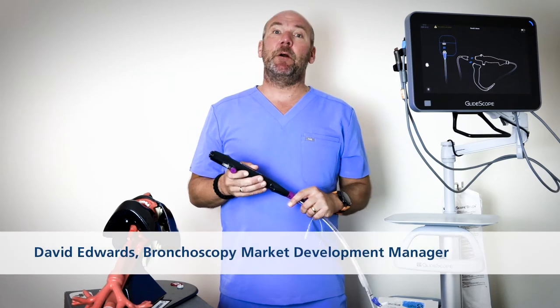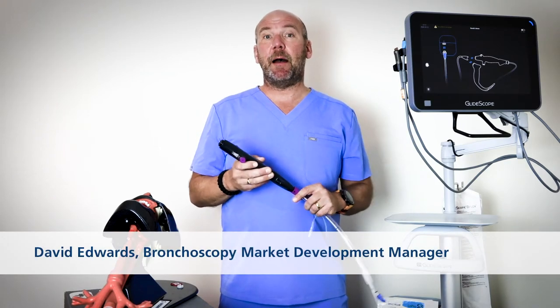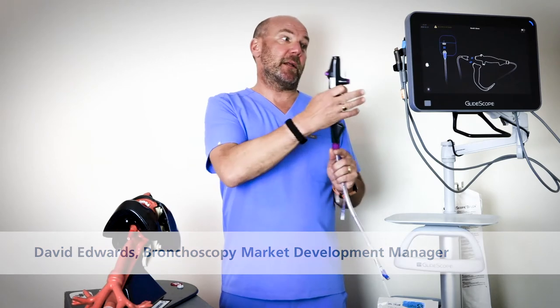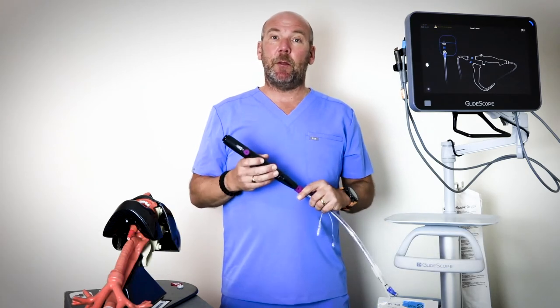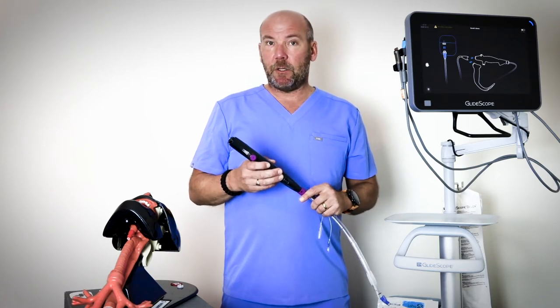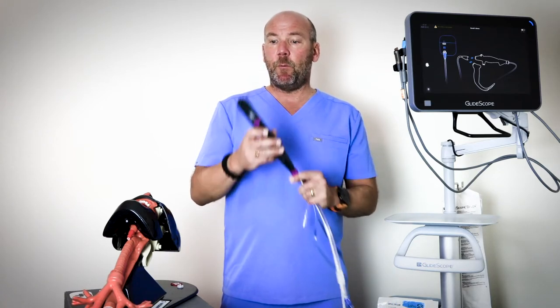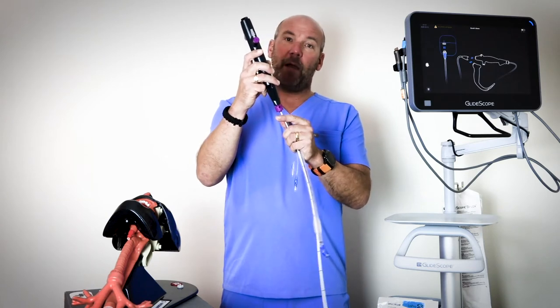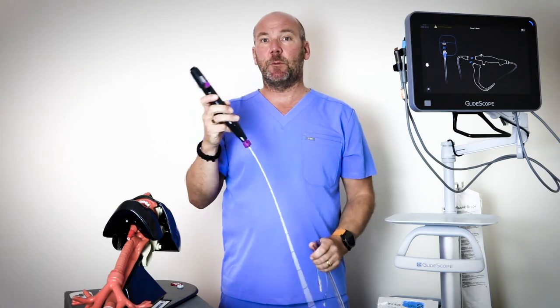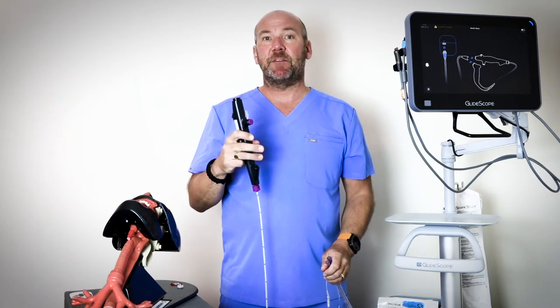Hi, I'm David Edwards from Verathon, and I want to talk to you today about how GlideScope Bflex single-use bronchoscopes together with the GlideScope Core system can help you to manage airways in the operating room. The scope I'm with today is the GlideScope 3.8, which can fit nicely through a 35 French double lumen tube and size 5 ET tubes.